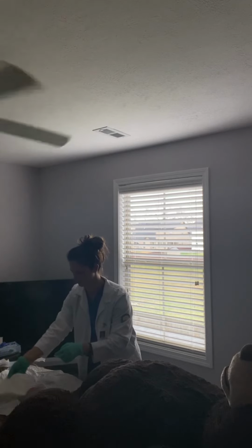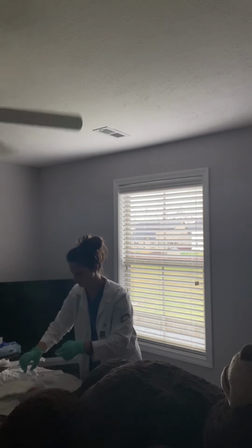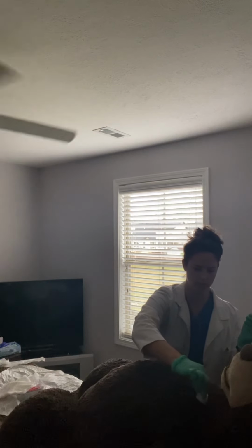And I'm going to take 3 pieces of gauze here. And get our pad off to the side there. Okay. So we're gonna take one, starting with the least contaminated part. We're gonna swipe down the middle of the wound. So going down, making sure you don't contaminate yourself, and reach around your field, throw it in the trash bag.